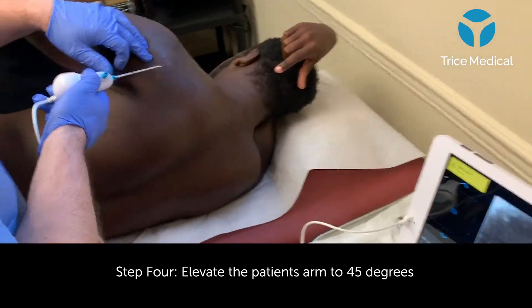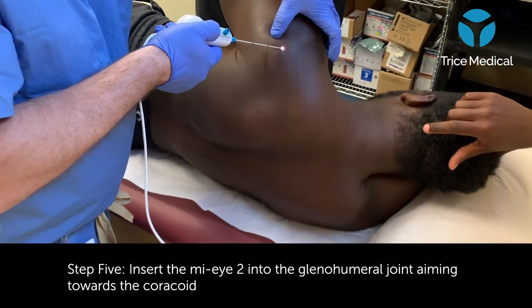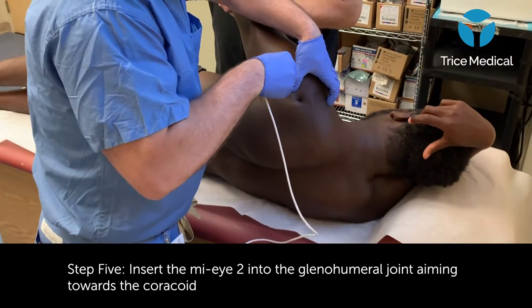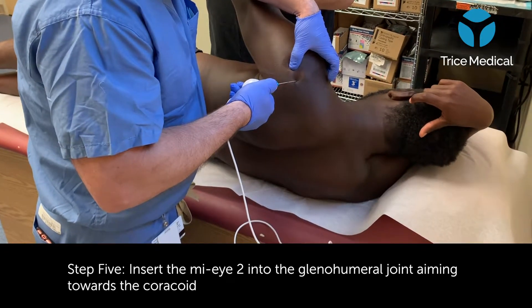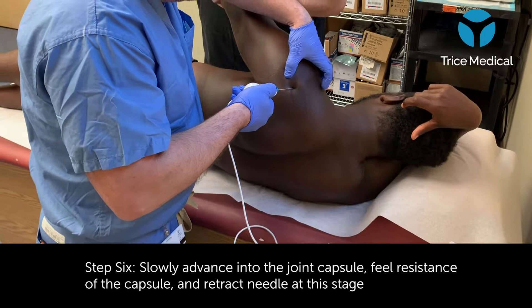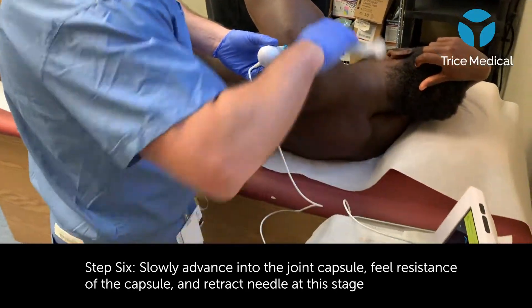With the arm flexed to 45 degrees and slightly flexed forward, I will insert my MyEye into the joint. After accessing the skin, I will feel resistance at the capsule and I'll enter slowly. Once I've penetrated the joint, I'll retract the needle, bringing the light source into the field.